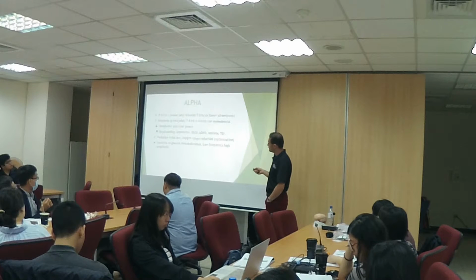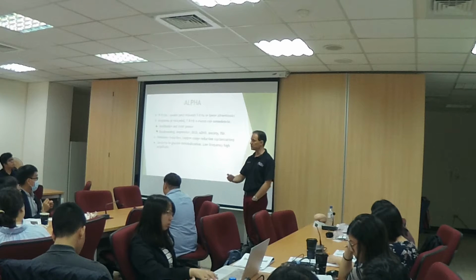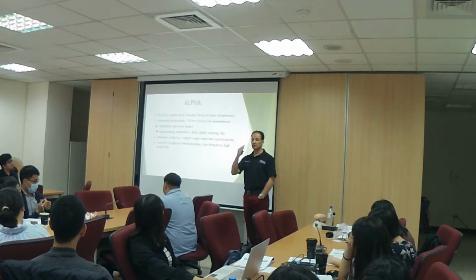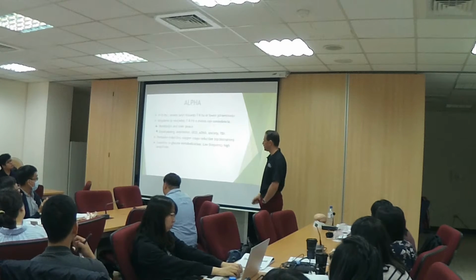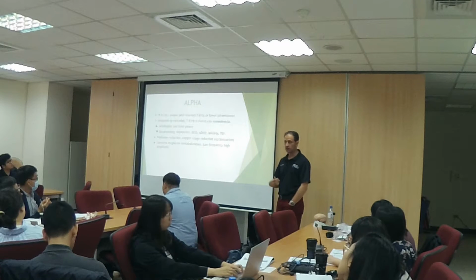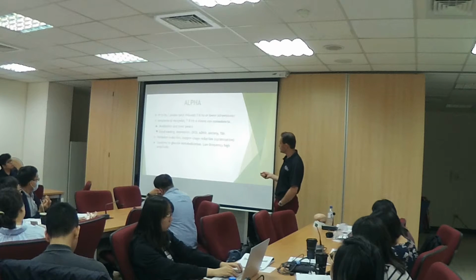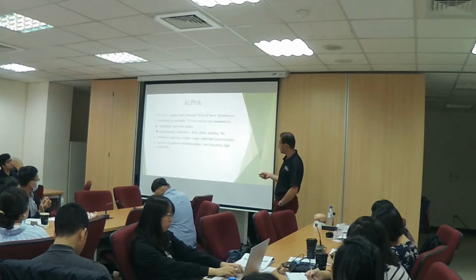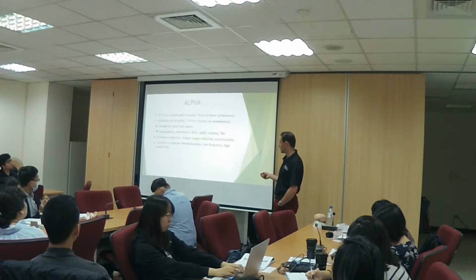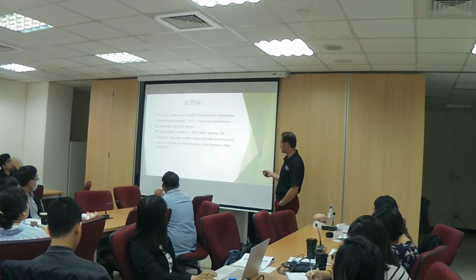But you can also have fast alpha and be anxious, because that's one of the subtypes of anxiety. Alpha over 10 hertz, and then synchronous alpha over 10 hertz is going to be a lot of anxiety. Okay, so this is your anxiety type or depression. It means meditation and inner peace, awake and relaxed, is related to daydreaming. So if you have alpha below 10 hertz, daydreaming, it could be depression, either above or below. It's related to OCD, ADHD, anxiety, it could be a sign of a TBI.